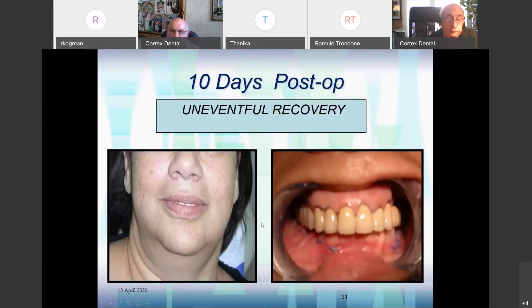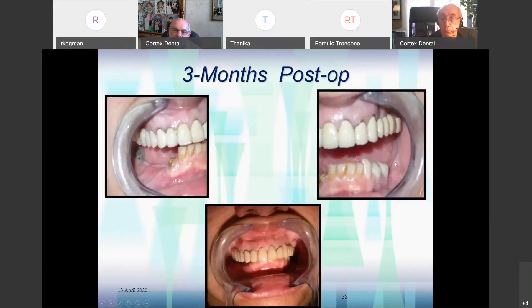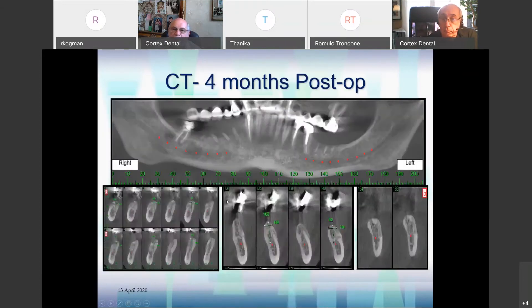This is 10 days post-op. You can see uneventful recovery. On the panoramic x-ray you can see the donor site. From one donor site we had enough bone wedges for all sites. And three months post-op — you can see the tissue here. You can see the bone in between the bone wedges, and look how the crest becomes straightened.